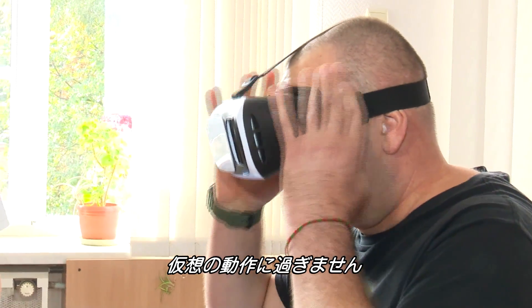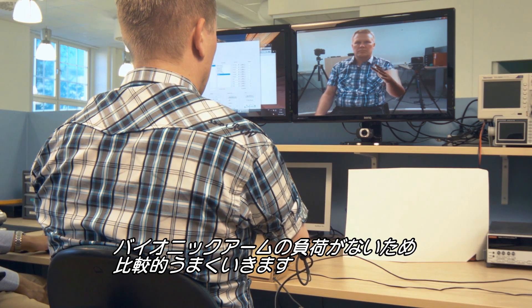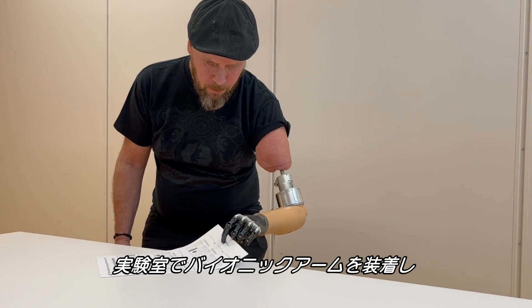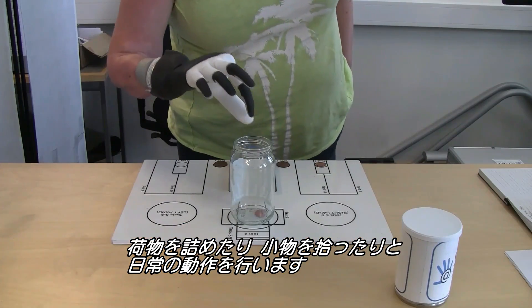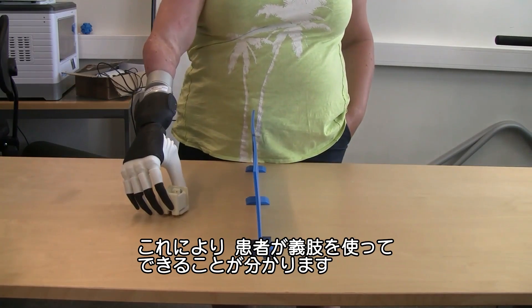Working in the virtual world is one thing. Without the bionic arm attached, patients do relatively well because there's no load. So the final step involves fitting the prosthesis and testing in the real world. Patients come into the lab, put on their bionic arm, and perform daily tasks like packing a suitcase or picking up small objects — tasks that reveal how well the patient functions with the prosthesis.